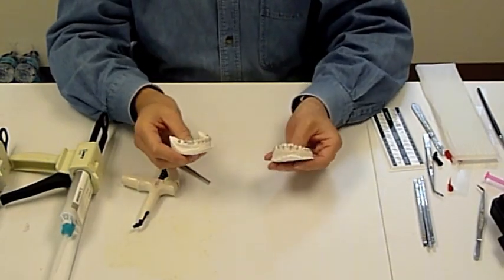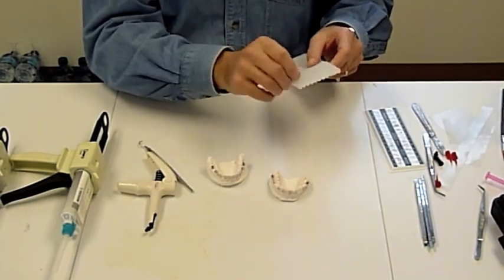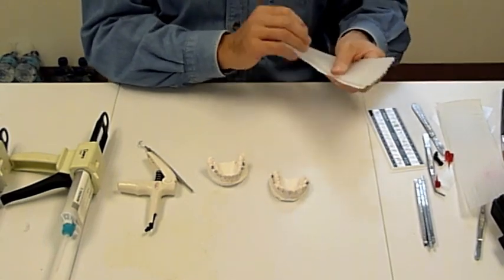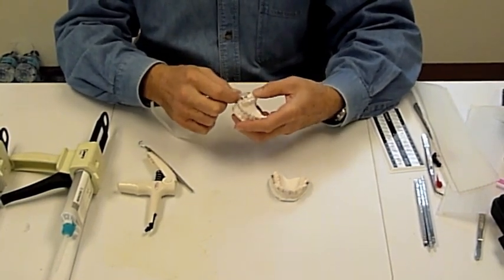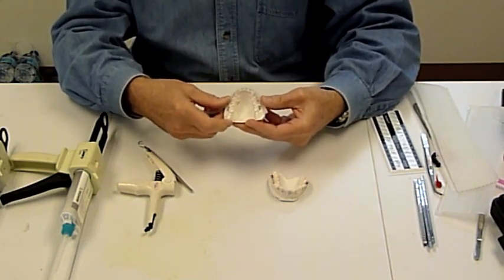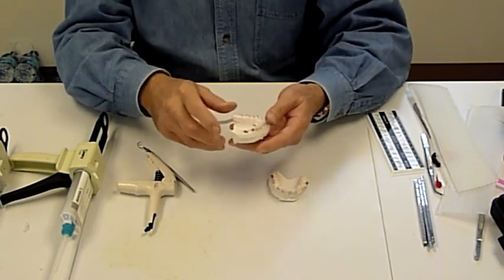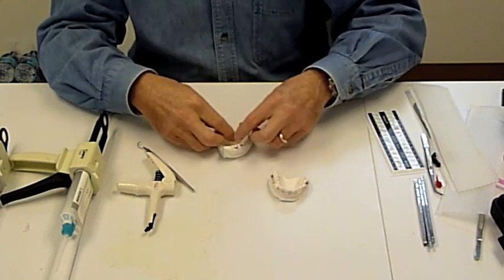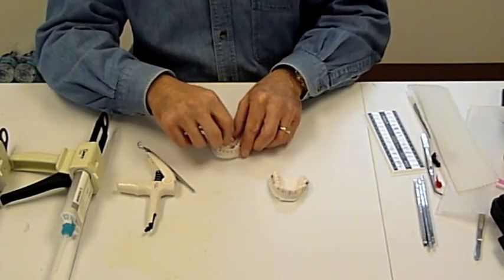Now we have our models with our brackets placed and cured. It's time to use boxing wax, white wax, to create a wax seal around our models. You place the wax so that it is just below the brackets, and we place it on the lingual or palatal side in order to create a stop, a positive stop on the occlusal surface.